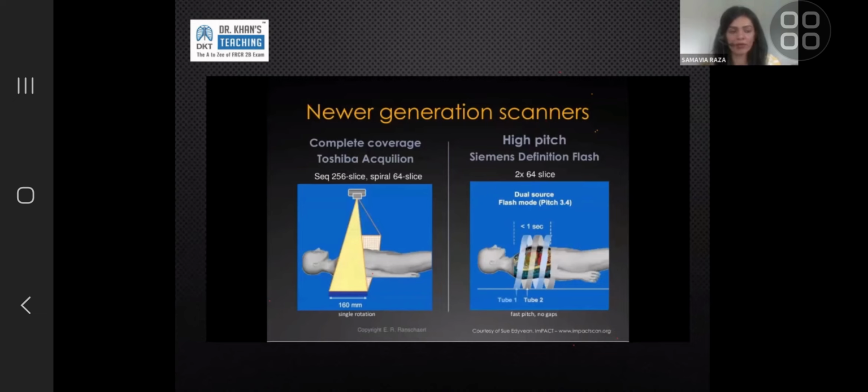That's when you have a detector so wide. For example, if I'm lying on a CT scanner table and the detector is 16 centimeters wide, my heart is not longer than 16 centimeters, or at least the important bit where the coronaries are. So you can literally take one snapshot across that detector and cover the whole heart. It may be different for exceptionally tall people, but an average heart you would be able to image in 1 or 2 rotations of the gantry. So that's the benefit of having a wide detector. Even 16 centimeters you can get these days. The wider the detector, the less time you need.